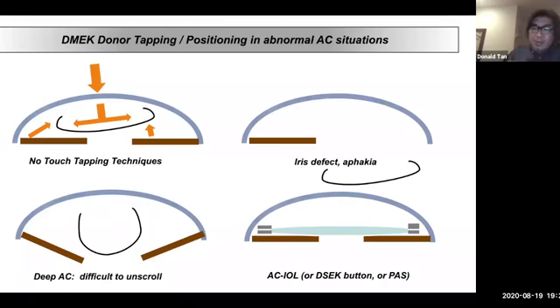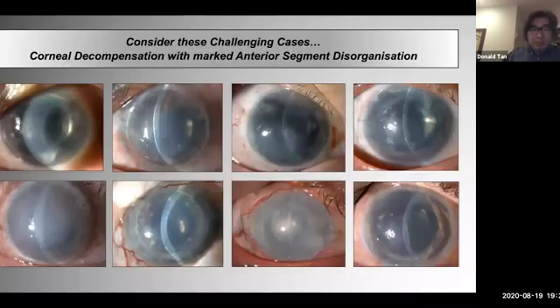So when we have abnormal iris cases, there comes the challenge, and it's very difficult or more challenging to do your standard tapping. So moving along and thinking about how to handle this situation, I realized that the AC is the problem. These are some of these cases. So here you will see whenever we have anterior segment disorganization, mostly from previous cataract surgery or glaucoma surgery or angle closure glaucoma, or any of these sort of cases, or a previous PK in which the chamber has been abnormal, the iris is abnormal.